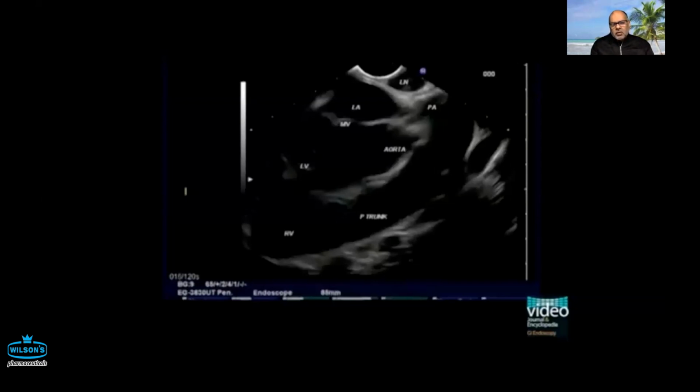Again, having said that, if you have a surrounding structure, a tumor around it, and you think this is really near that and it is important to sample the lymph node, you can. But in that particular case, you already have the tumor there. So endoscopically, just on appearance, you'll be right probably 75 to 80% of the time, but that's why you have to do the biopsy.